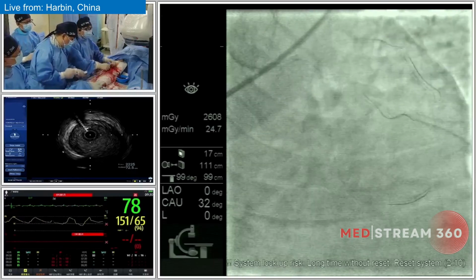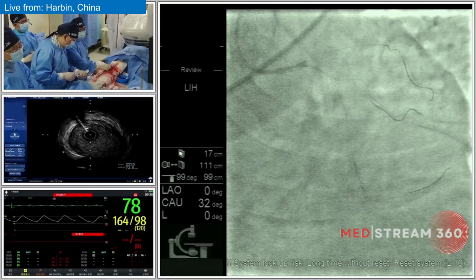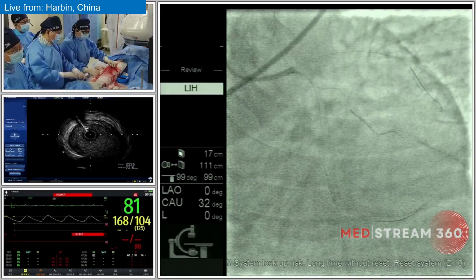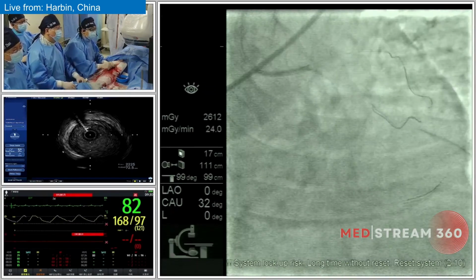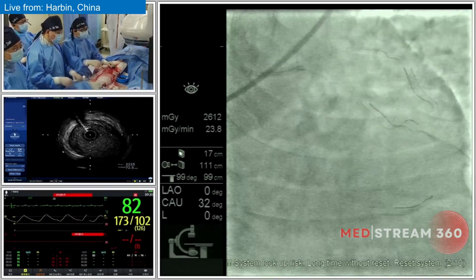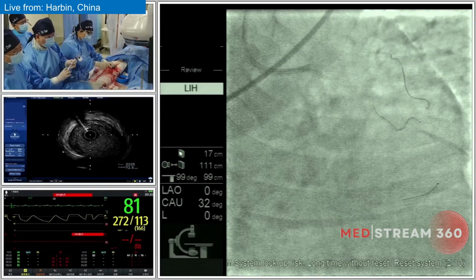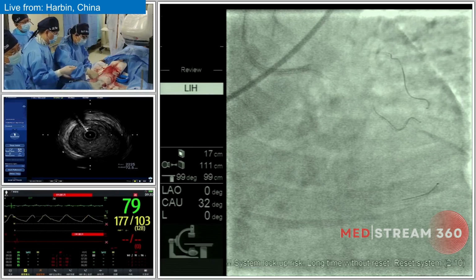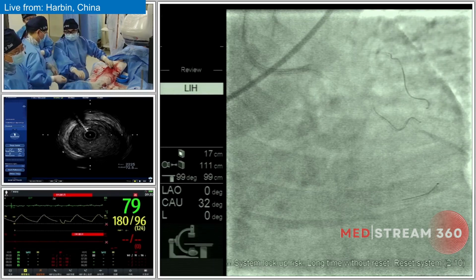The third advantage is that the existence of the first wire reduces the risk of the higher penetration wire going outside the vessel through the CTO body, by acting as an indicator of the vessel course.